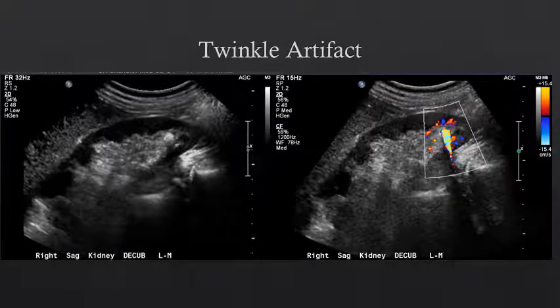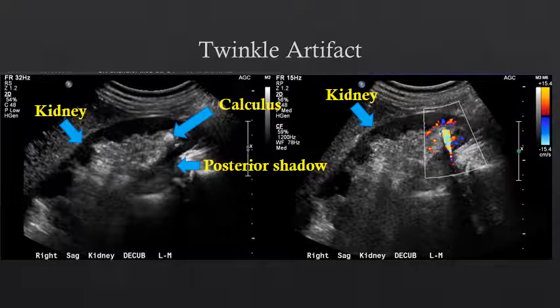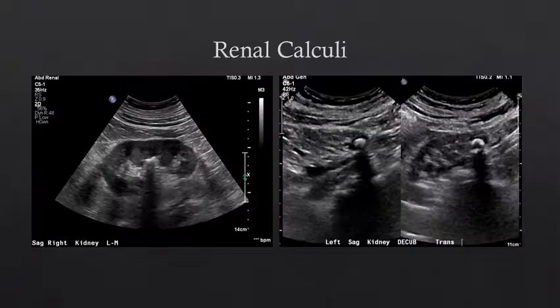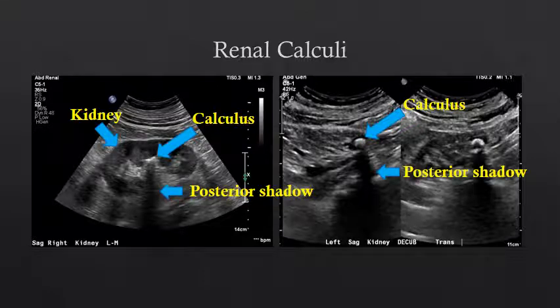Another trick to differentiate renal sinus fat from calculi is Doppler ultrasound. When we apply Doppler ultrasound onto a suspected calculus in the midst of hyperechoic renal sinus fat, we see a twinkle artifact — a very bright area of aliasing — that gives us high confidence that this is a renal calculus. Here are additional examples showing the calculus with posterior acoustic shadowing, confirming it is not just echogenic fat but an actual calculus.